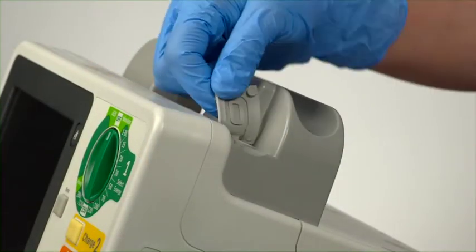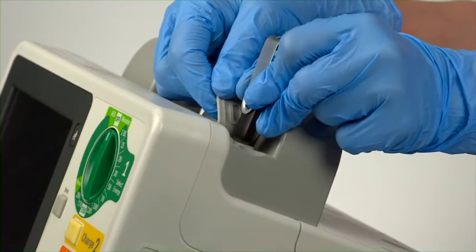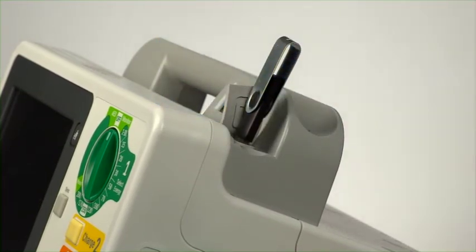The USB data port allows you to save data for transferring patient information or to import configurations and new software revisions.